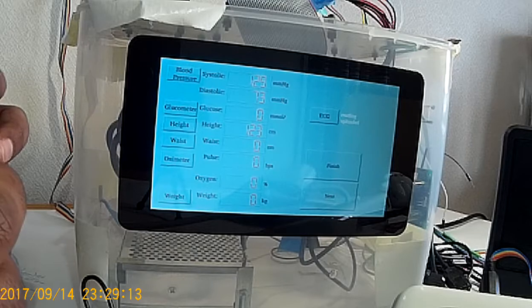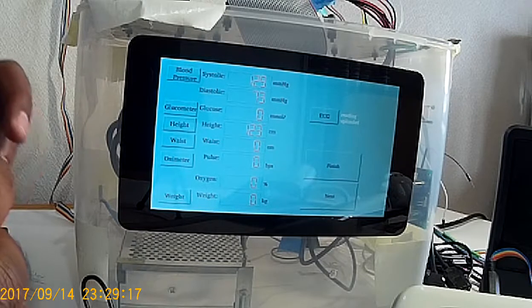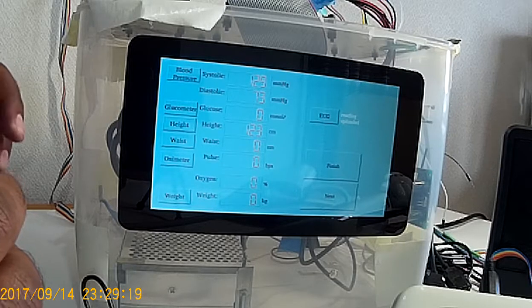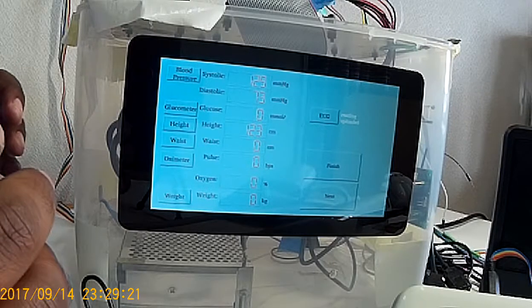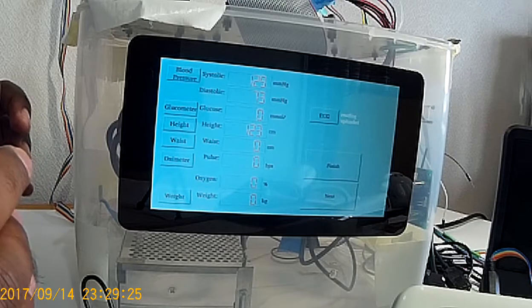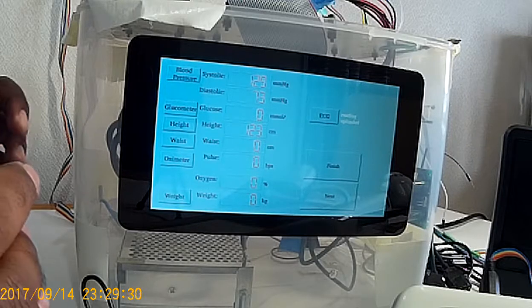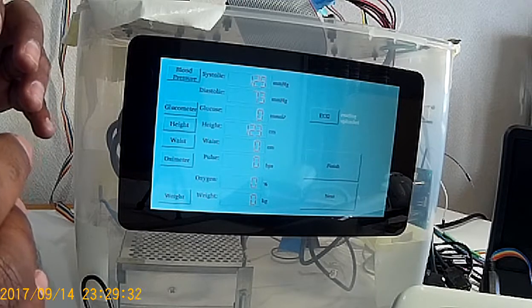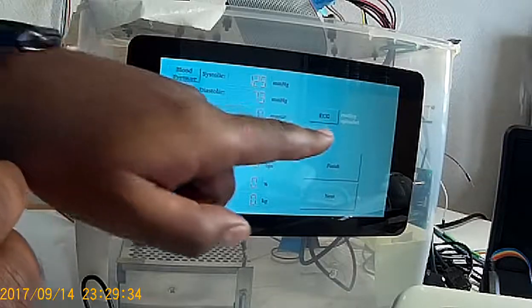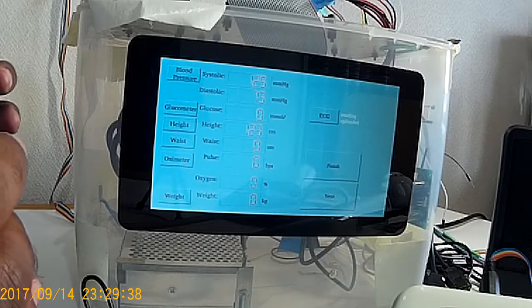The sinusoidal wave, or the signal from the heart activity, will be plotted on a chart which is readable by a professional medical person, and that plotted chart will be uploaded into the server for that specific session.